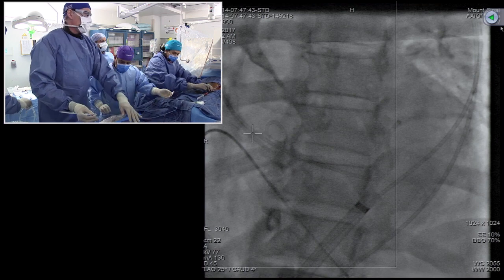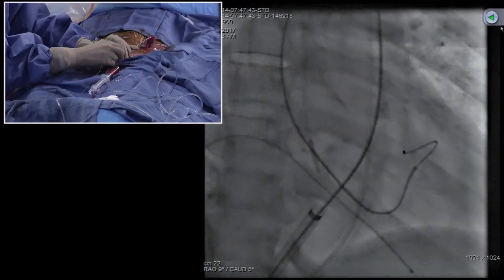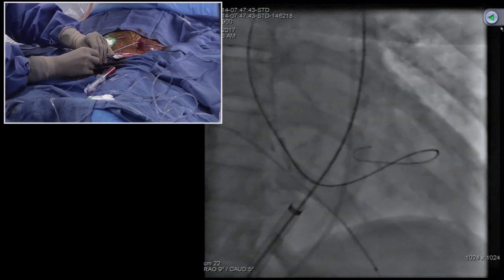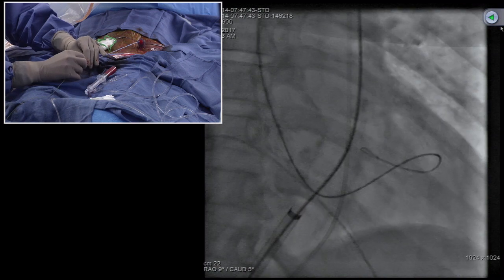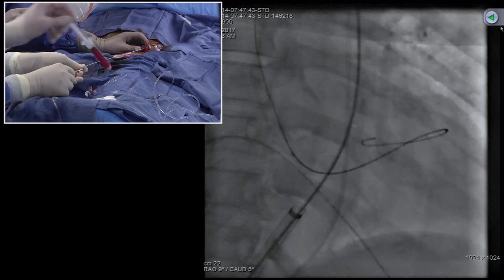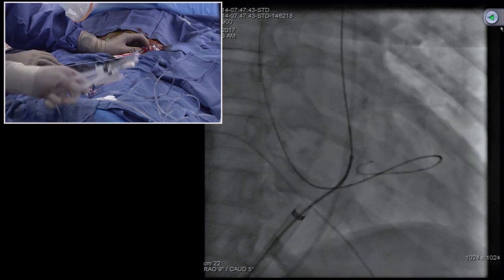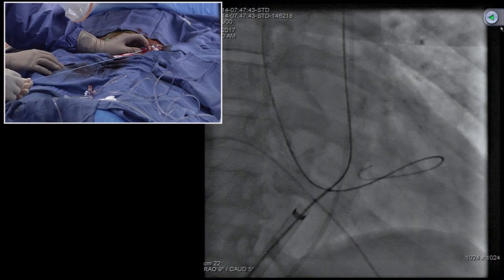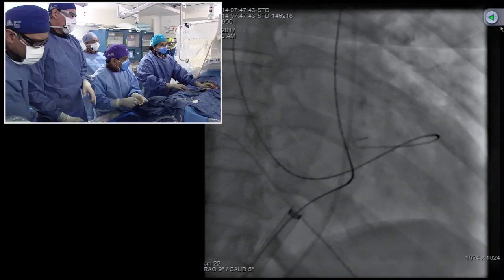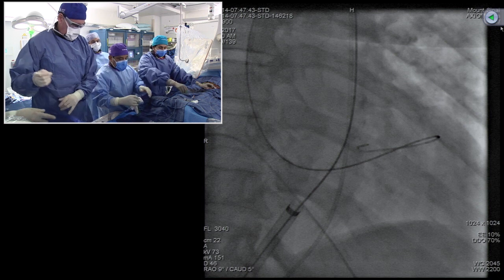Yeah, but I mean, we are prospectively looking for it. We established the protocol that appropriate cases should get Sentinel, although we know that various meta-analyses are still questioning the overall device utility, but FDA has approved it. In appropriate cases, you still feel the utility, as long as you are not creating emboli from the device placement. Yes, it takes a little more procedural time of 5+ minutes, hopefully a very small amount of dye, but ultimately it will decrease your stroke rate by 30-40%, that actually has been shown. It may not be statistically significant, but relative reduction is always there.